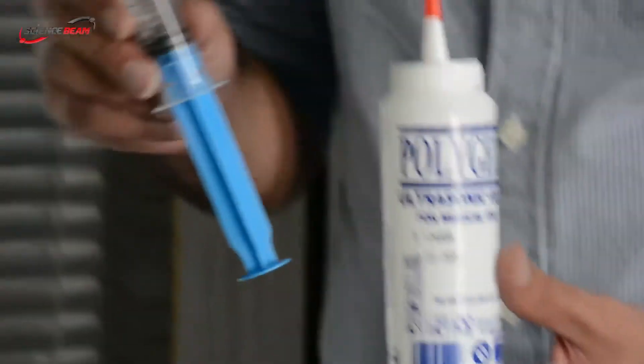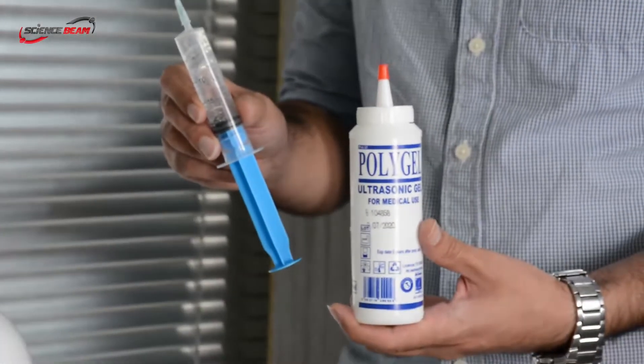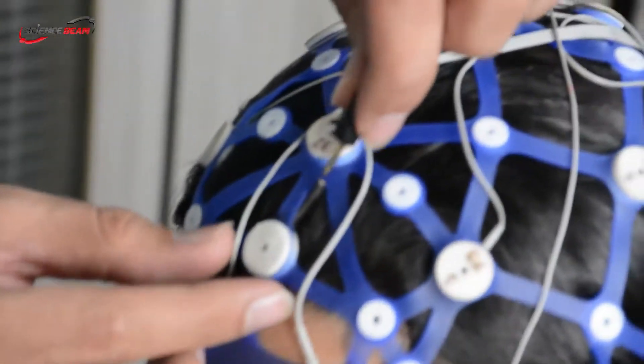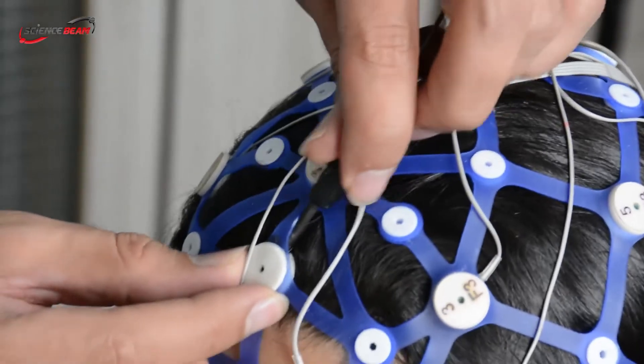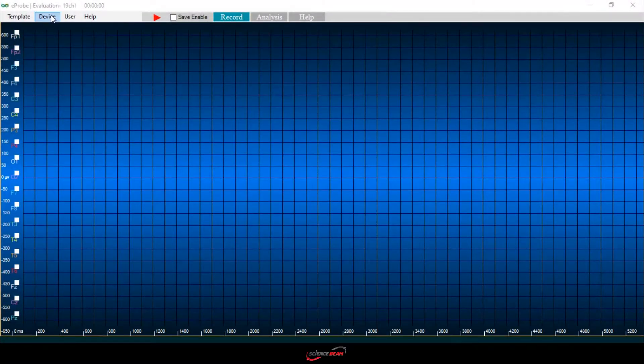Now let's start injecting gel into the channels. One of the most exclusive advantages of the eWave is that you can use ultrasonic gel for recording instead of EEG gels. Ultrasonic gels are much more cost effective.